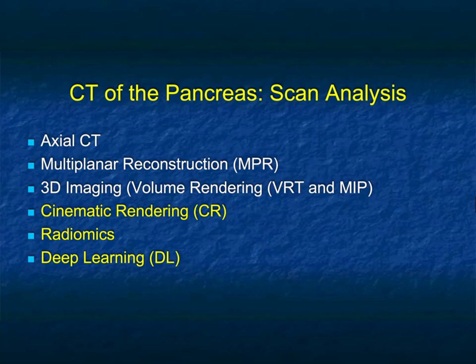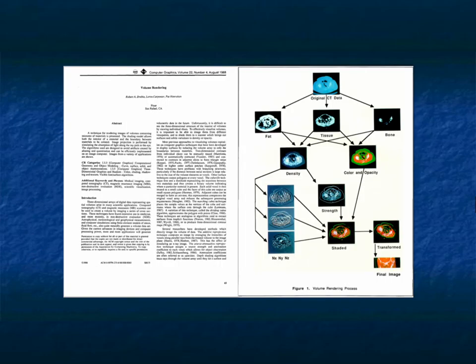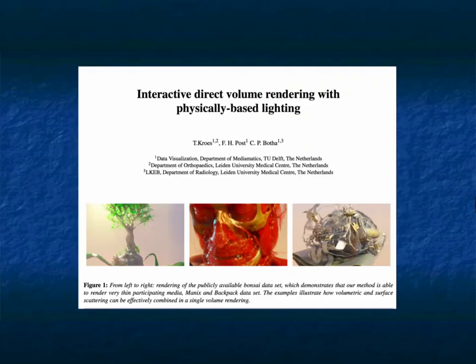So at the end of the day, there's three things we need to do. And I think these latter three things will change the curve and surely bend the curve in favor of the patient. Now, volume rendering, that's the Pixar guys, right? Drebin, Carpenter, Hanrahan. And then we did work on that for many years. Volume rendering, state of the art.